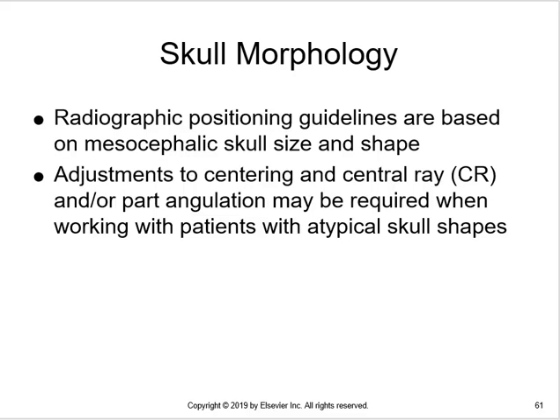So skull morphology, we talked about different shapes of the skull, but because of the different shapes, we may have to adjust our central ray in order to compensate for different skull types. What we're going to talk about and what you'll be tested on all the way through the registry are angulations and positioning for mesocephalic skulls, so average skulls.